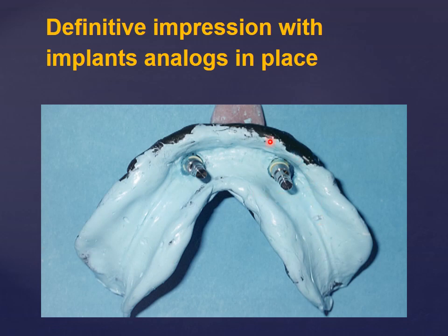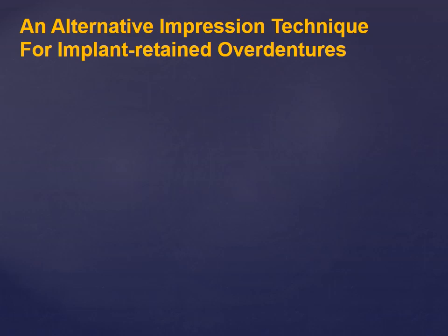And we can see the final impression after removal from the patient's mouth and adaptation of the analog over the impression post.